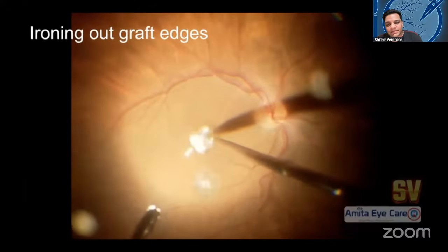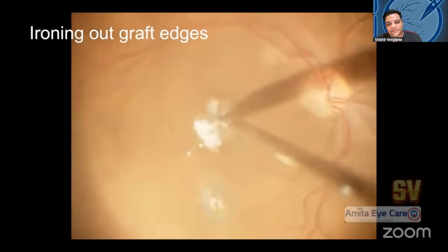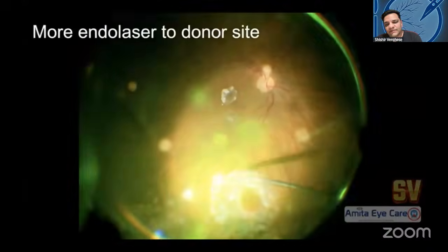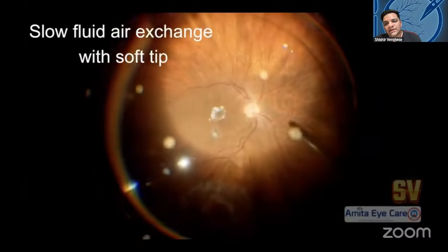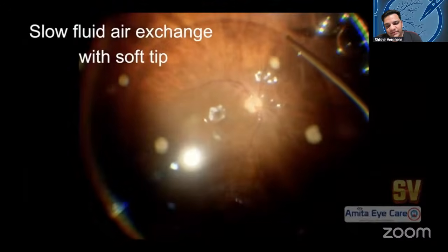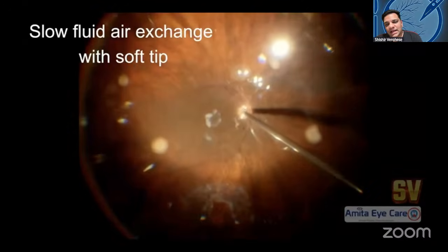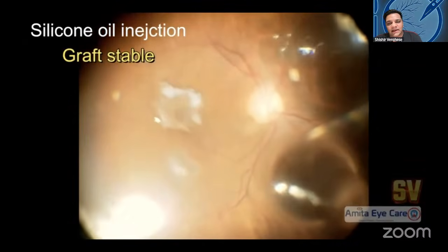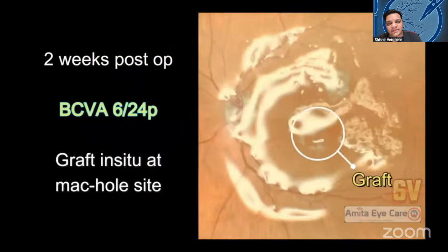And then after putting PFCL, under the PFCL, I drag the graft. You have to drag it all along the retina. If you lift it up and put it, it tends to crumple, and then you have to flatten it under the PFCL. So once I put it over the hole, and I identify it by the presence of the cautery marks which are on the surface, and then after putting PFCL, I exchange with silicone oil.